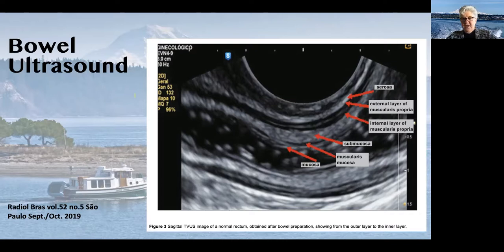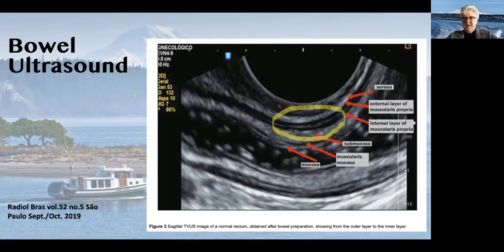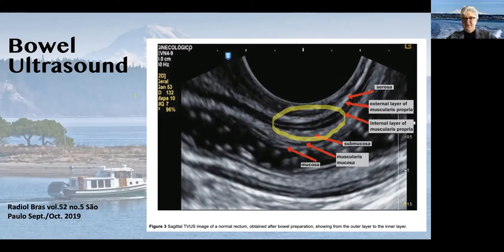This image is a beautiful picture of a bowel wall. You will see the muscularis — these dark areas with the thin white line in between. The muscle is dark and the potential space between the outer and inner muscularis is this skinny little white line. The submucosa and mucosa are inside of this and the serosa obviously outside. This was done in a patient who is bowel prepped, and you will not get this beautiful of an image in somebody who has not been bowel prepped.